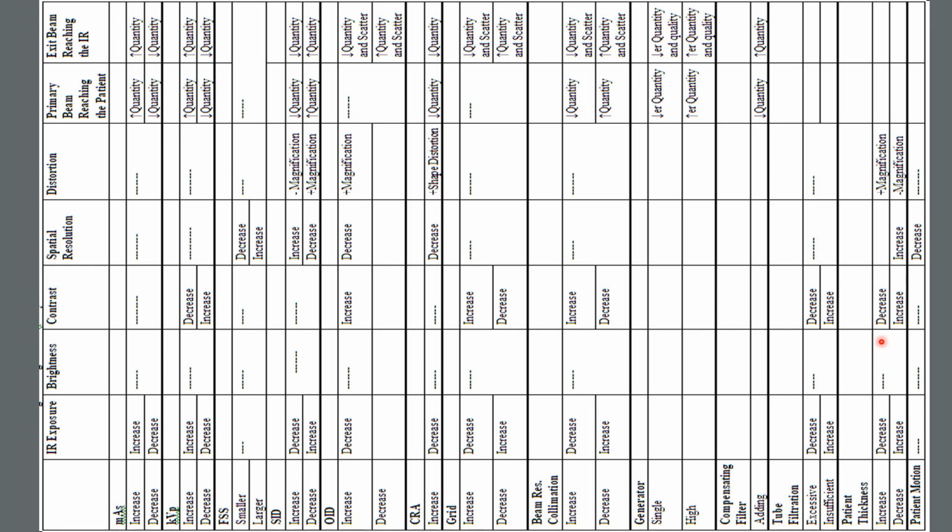Remember, the AEC, which is discussed in the physics playlist, will not operate correctly if the patient part is not completely occupying the AEC area. So it will either shoot too light or too dark in these situations. A fixed technique will work regardless of whether the part is taking up the whole area. Also, on portables, the large majority don't have AECs. From my understanding, some do.